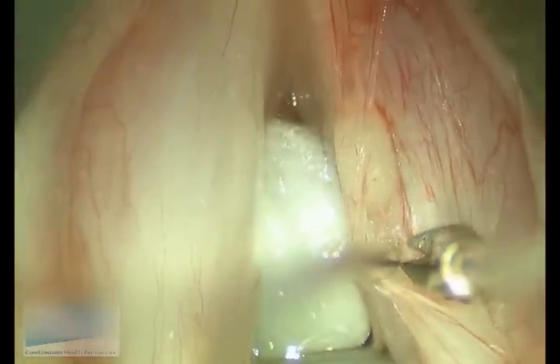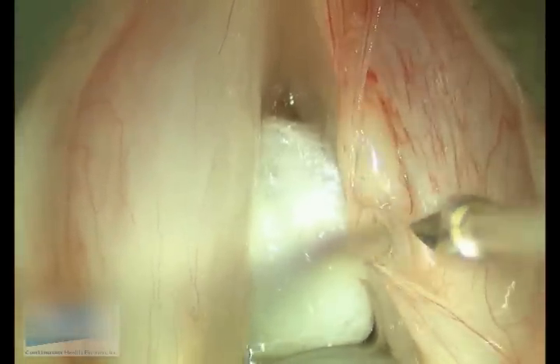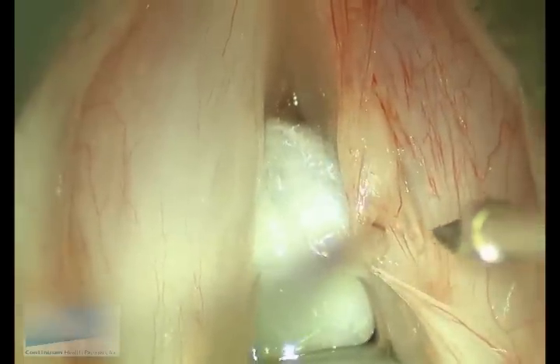Occasionally, sharp dissection with an instrument such as a scissor is necessary to transect the stronger fibers and adhesions.